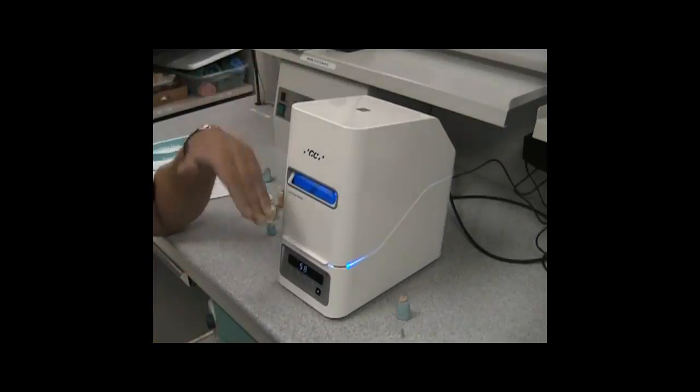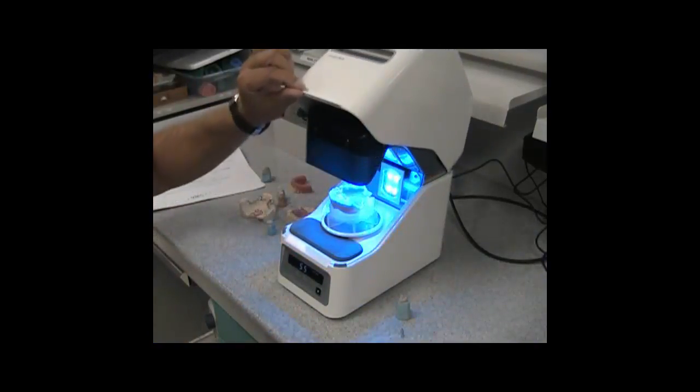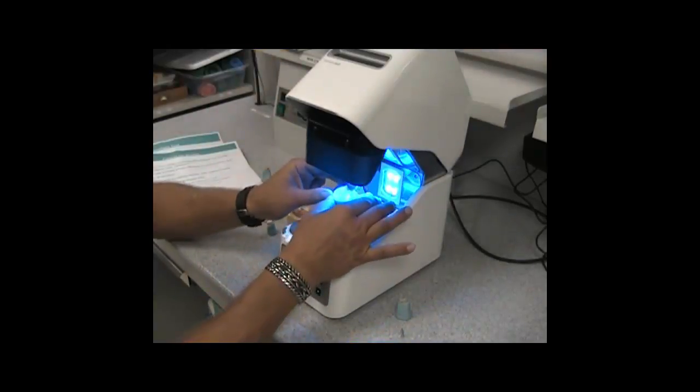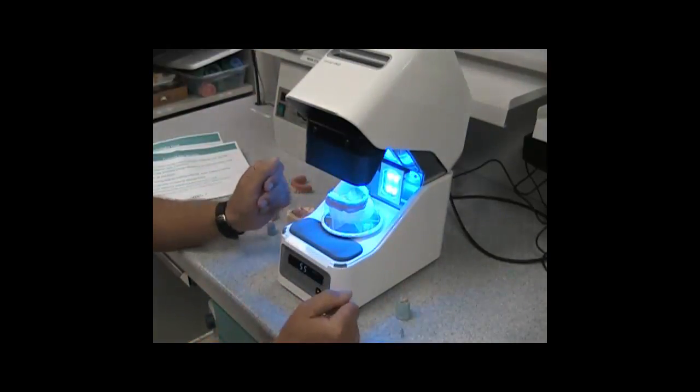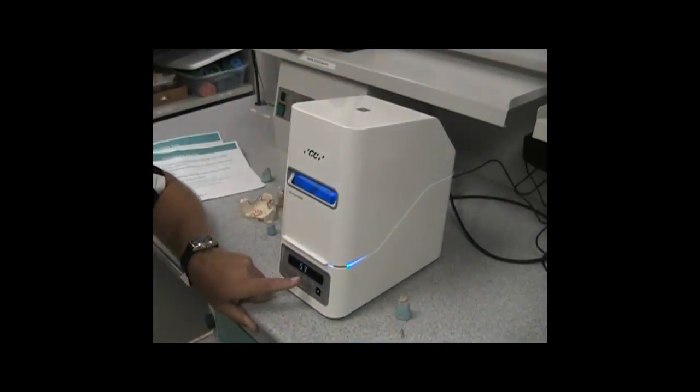So if I have my unit in there and I need to go in to make some kind of adjustment, I can lift up the lid. I have a grace period to move something around or add something real quickly, and then still be able to close the unit, and it will continue with its cycle.